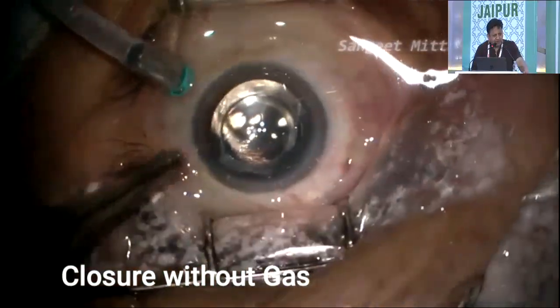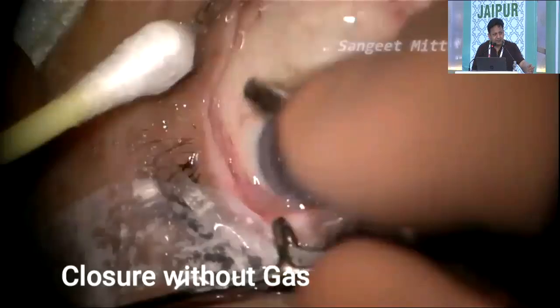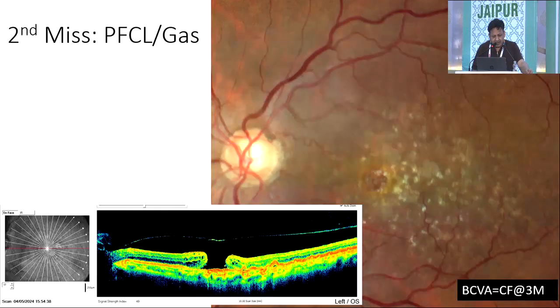I remember Dr. Eckhart used to close the macular holes with air only, and he never used gas. And I thought I'll try this, and I saw that there was no need of gas. Just with air, I got a good closure. The patient's vision had improved 6 to 12. And this was my next miss. That was a perfluorocarbon liquid.